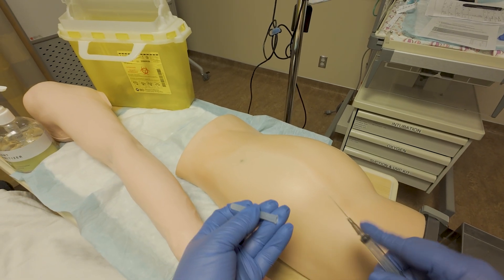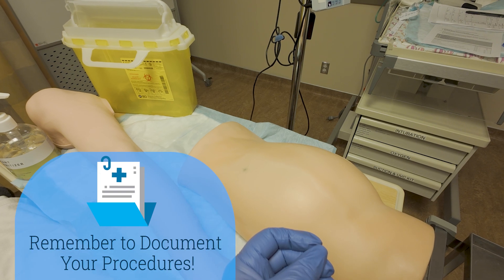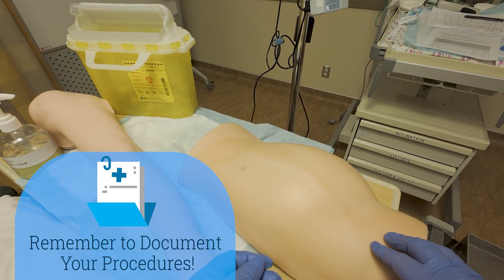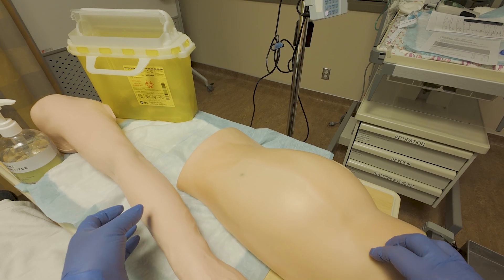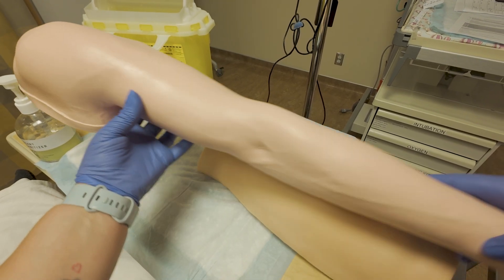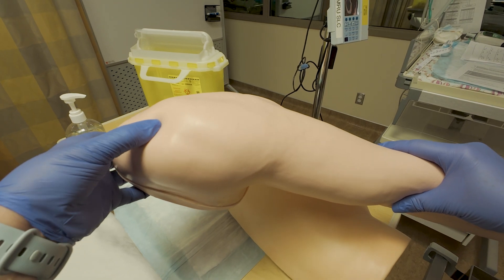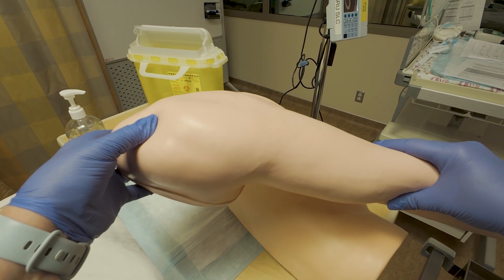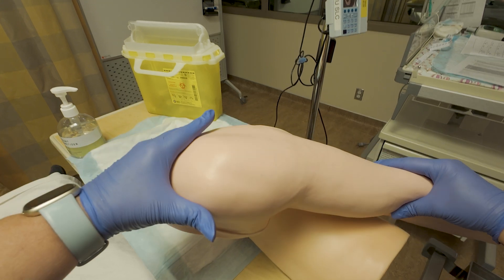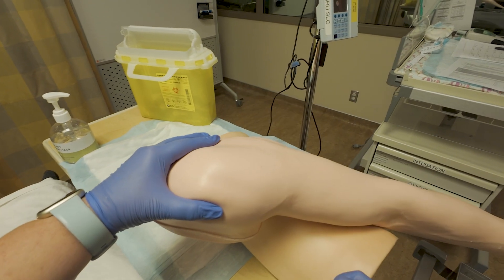We are going to document that either on paper or in the computer, depending on what our site uses. For a deltoid administration, you would identify the cap of the shoulder and where the deltoid muscle would be — right where my hand is — and go right into the center of that muscle.